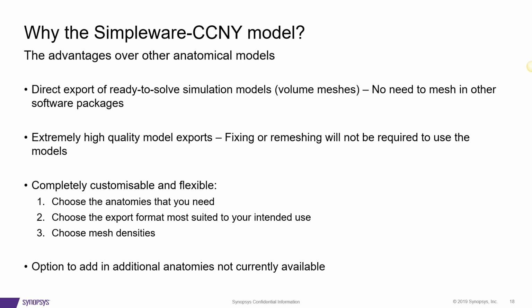And also, since the model was developed in Simpleware software, we do have the option to modify or extend the model as per your needs. So if there's a specific anatomy that's of importance to you that doesn't appear in our current model, we can look into adding it for your version and customizing it for you.